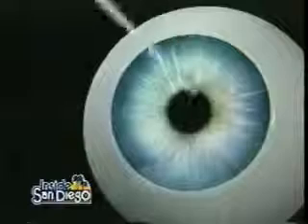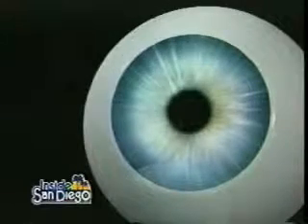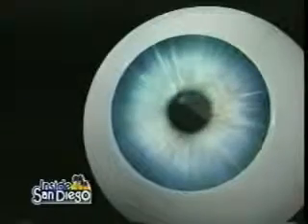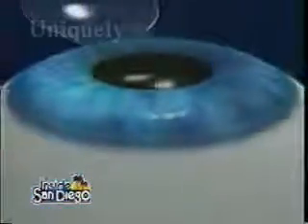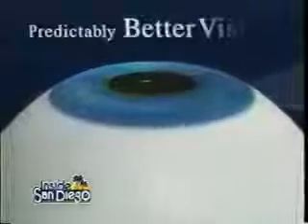Now, wavefront technology is basically the new advance of custom laser surgery. With wavefront technology, we now have the ability of measuring precisely 25 times more of the irregularities in the cornea. So it's more precise? It's more precise and accurate. Why is it called wavefront? It's a very good question.